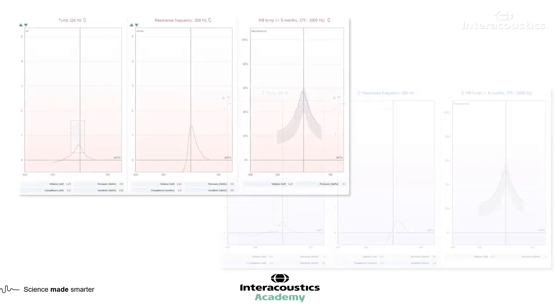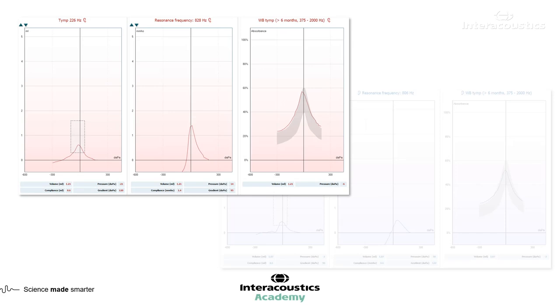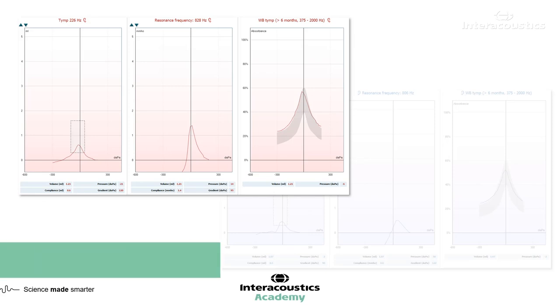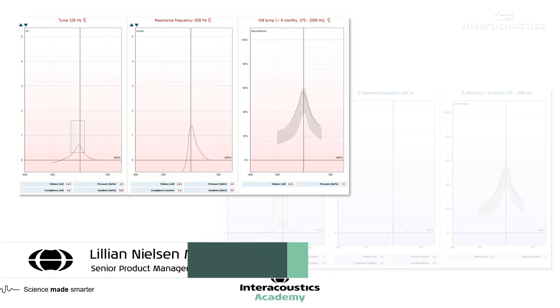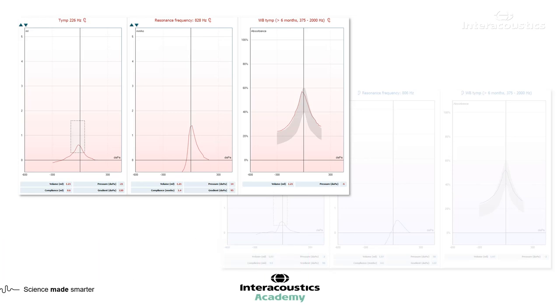Looking at the right side, there is not a huge amount of difference. There is nothing asymmetrical — it is all quite smooth and straightforward. The parameters of volume, pressure, and compliance all look normal from both the 226 Hz and the wideband average. Nothing raises any concern or alarm in this regard.